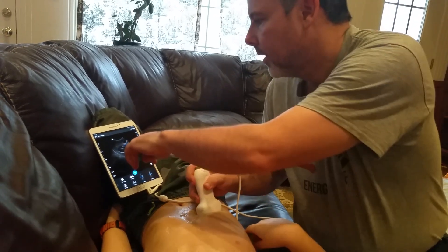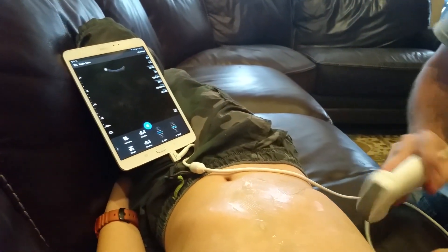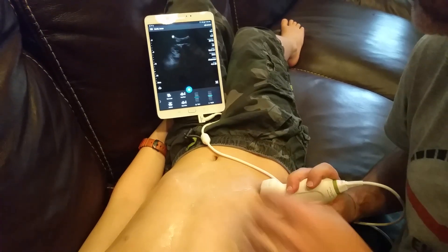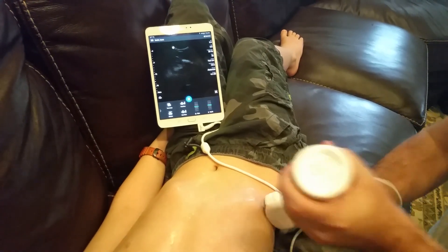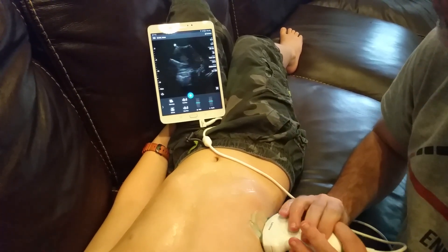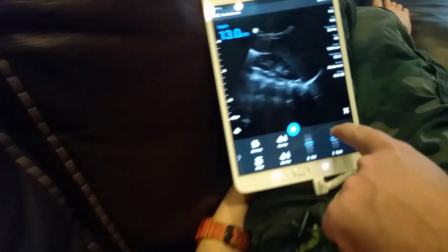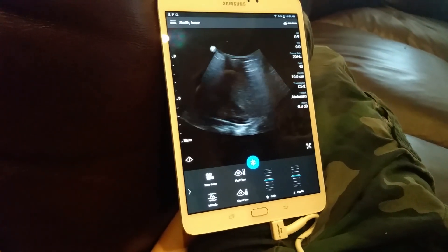Moving on to the rest of the belly, from the anterior aspect you can get a hint of other structures including the beginning of the kidney. To really take a good look at the kidney, adjust your view towards the side. This scanner needs a little more gain and some more gel. Start by positioning like this — there's part of the liver, and there is the kidney. Zoom in on the kidney to get a better picture.